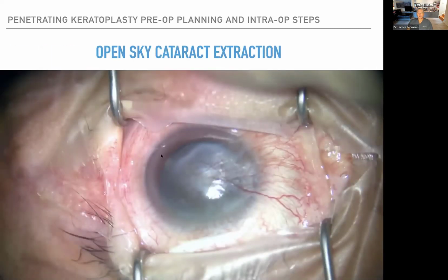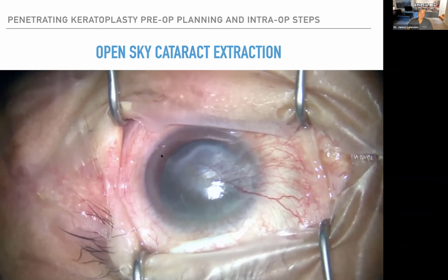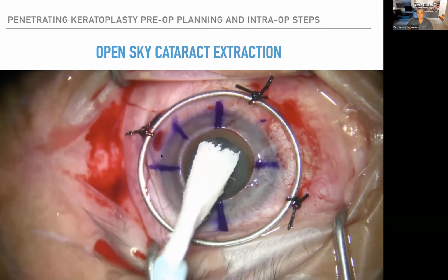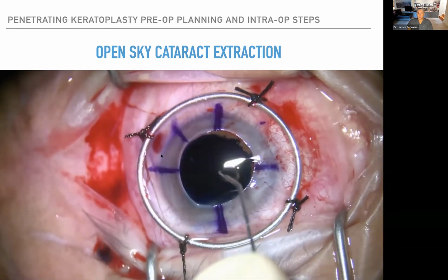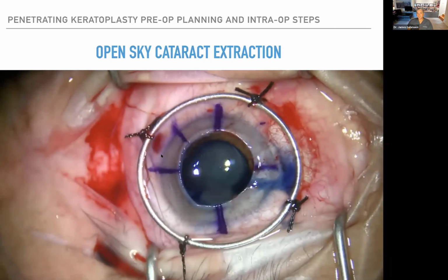Okay, open sky cataract surgery. This is fun. This is a video from Shenyang, China from a couple years ago. So we've taken the cornea off. It's under general anesthesia. We use a Weck-Cel to remove aqueous, and then we're going to trypan blue stain it. That's going to help. Even though you're not doing a CCC, a continuous curvilinear capsulorhexis, it still helps to visualize.